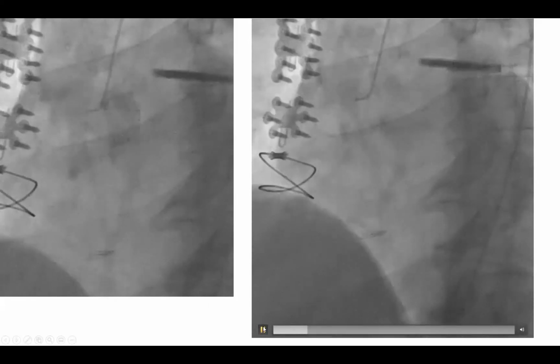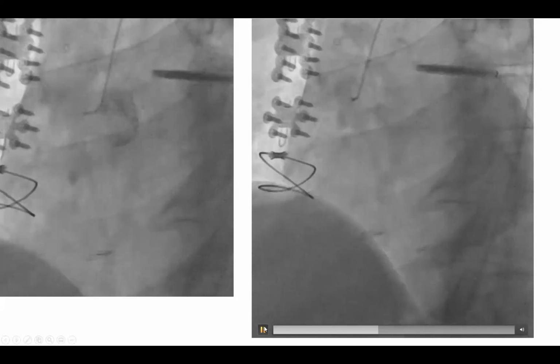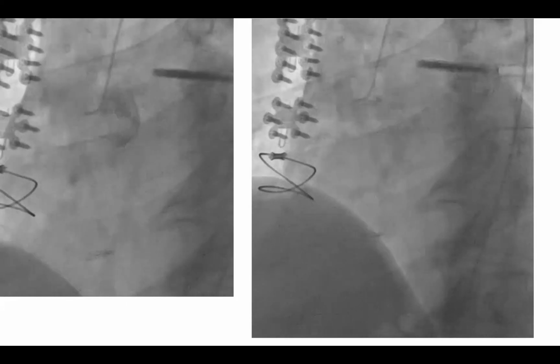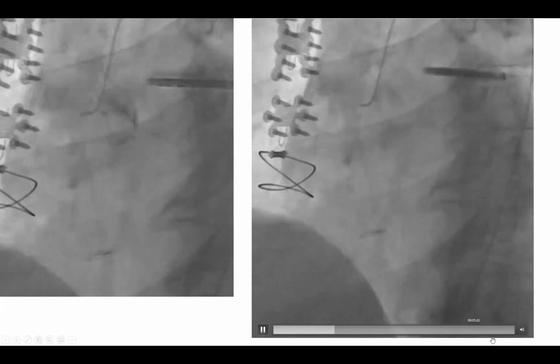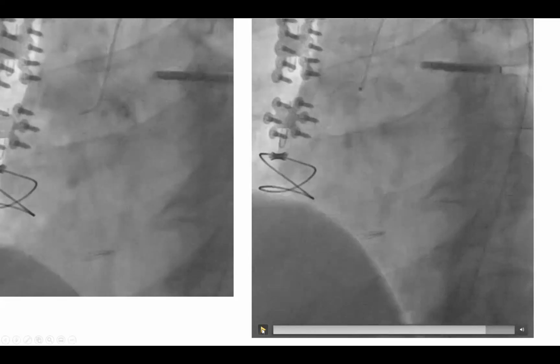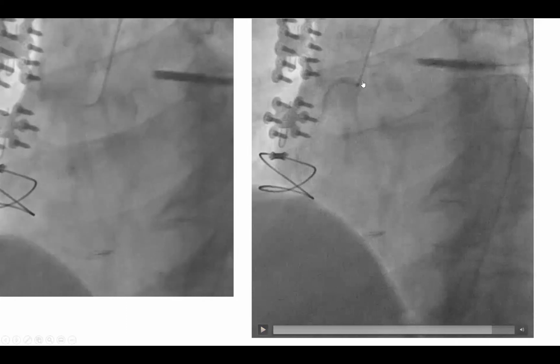And here another important idea for you. So we counterclock and pulled, and we engage. Okay, let me show it here. So we engage, we're in. But it's kind of not coaxial.